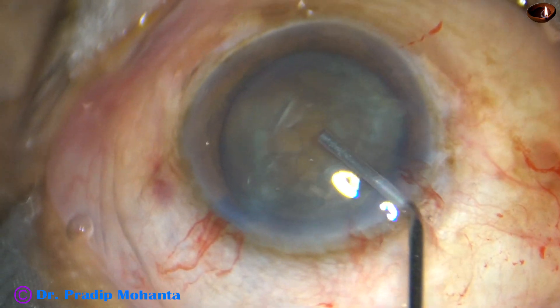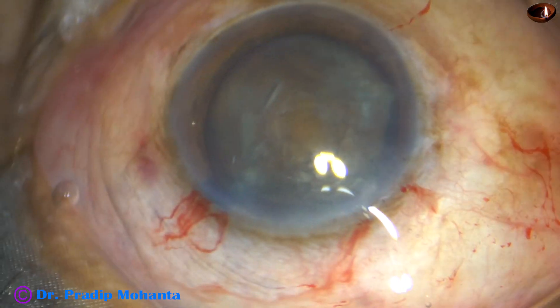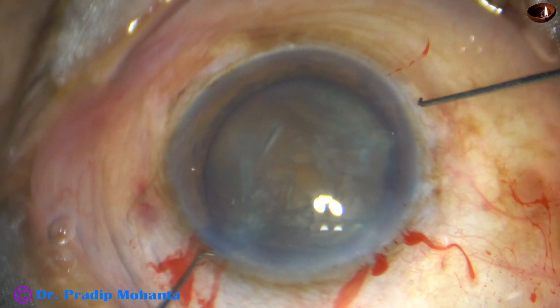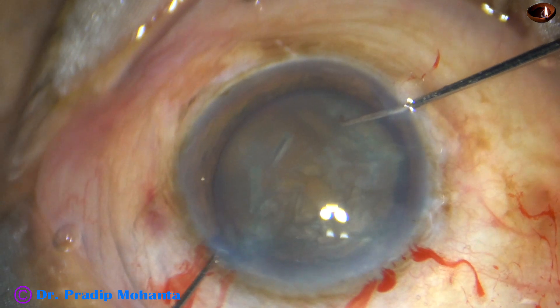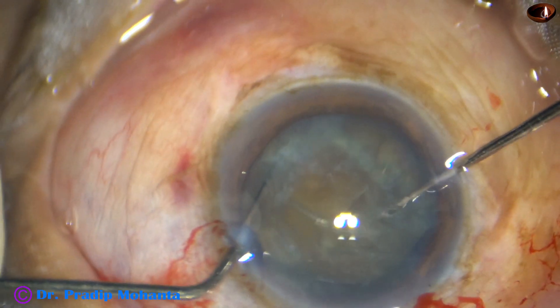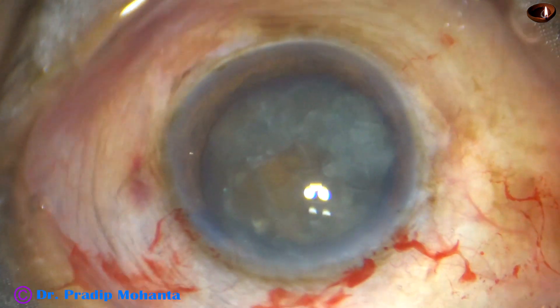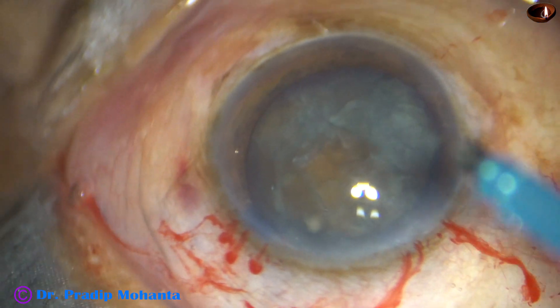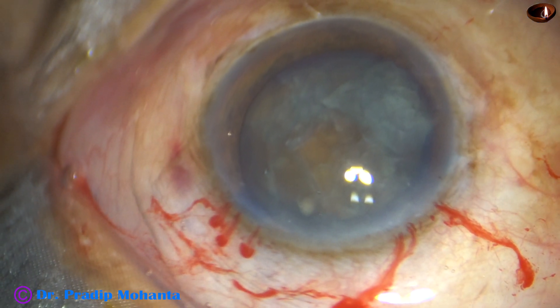And now I am injecting viscoelastic and going to rotate the nucleus bimanually. Bimanual rotation of the nucleus is like this — if you rotate the nucleus bimanually, stress on the zonule is less.